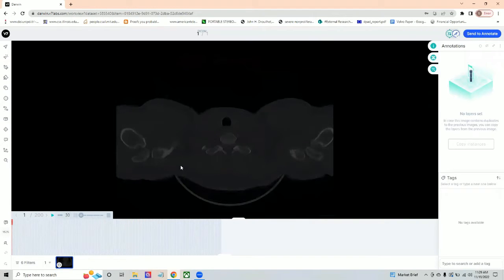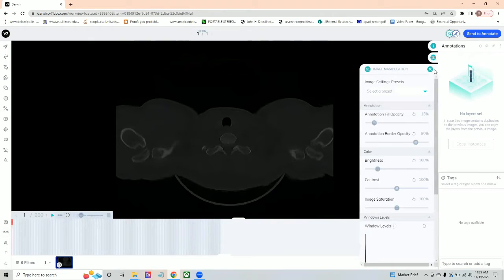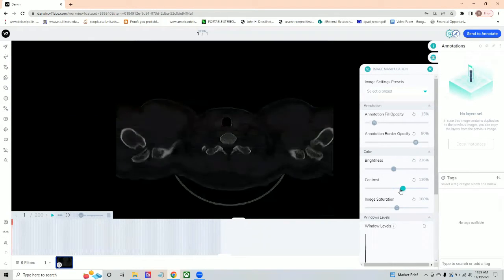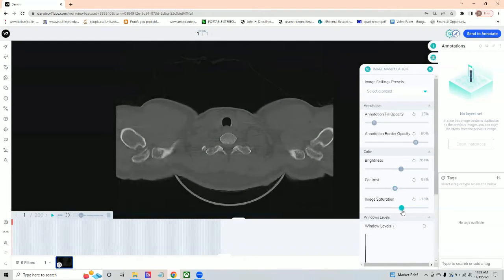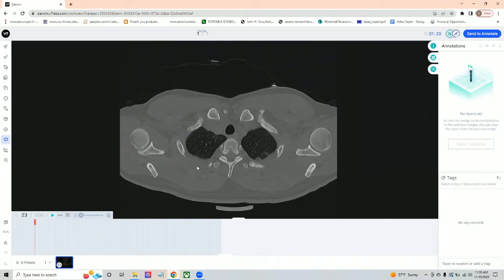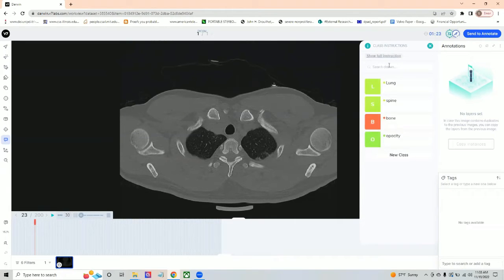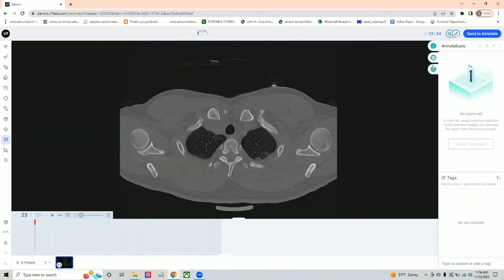Now, the important part is that sometimes you will see that the brightness and everything is not ideal. So you come to the third tab from the top, where you can manipulate the brightness and contrast in order to make it useful for your annotation purposes. Once the images are enhanced, we are going to go and add classes that we are going to annotate, and then I will start with the auto annotate functionality.